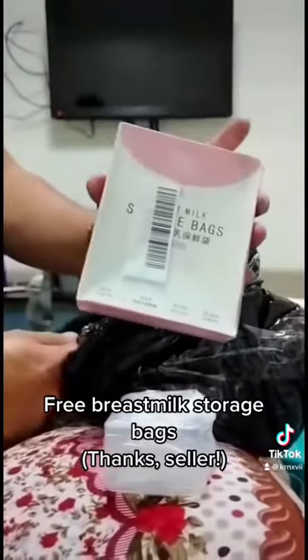Back to unboxing. Free breast milk storage bag — thanks, seller!